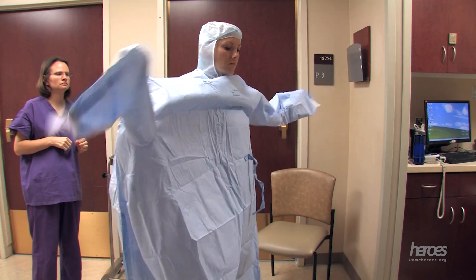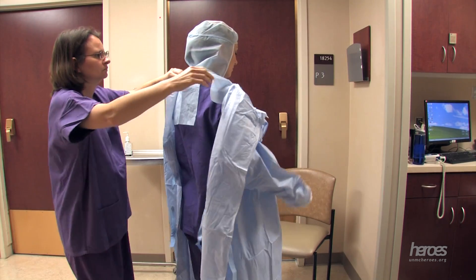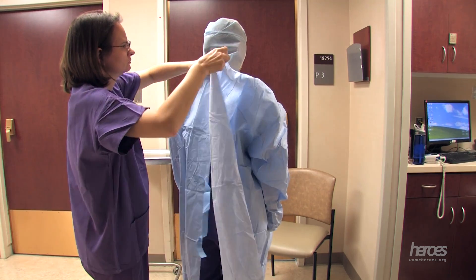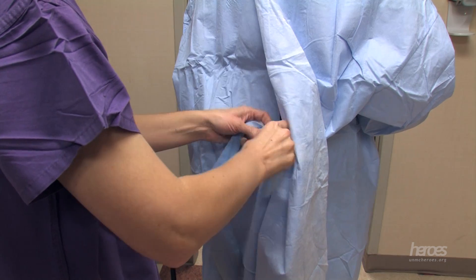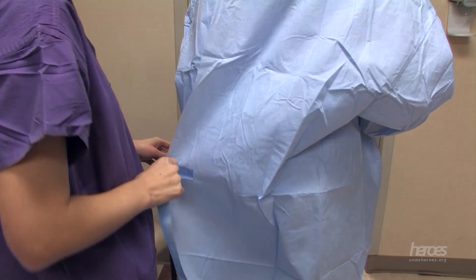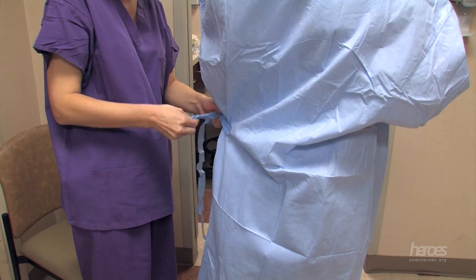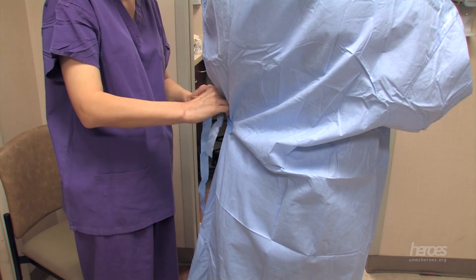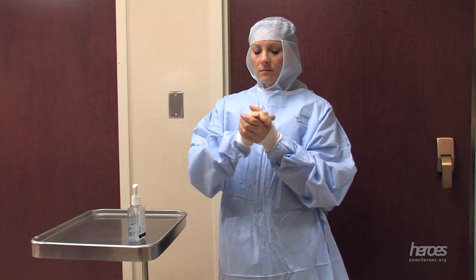The surgical gown should be donned next. You must make sure that it is not inside out. The upper part of the gown should be secured at the neck, and the lower parts of the gown should be tied at the back using simple bows. Once tied, make sure the gown fits well and covers the intended areas. Once the gown is applied, you should again perform hand hygiene.